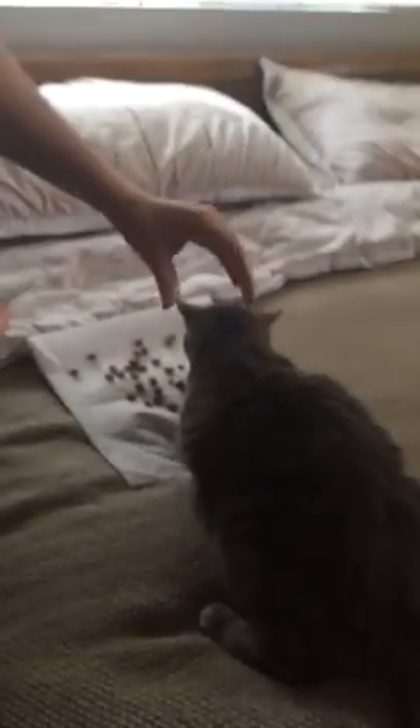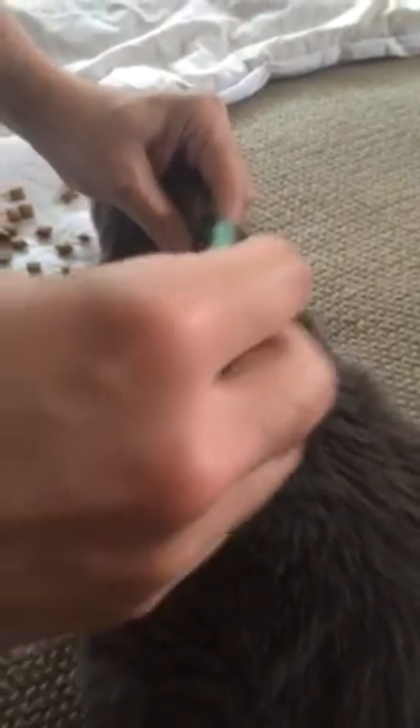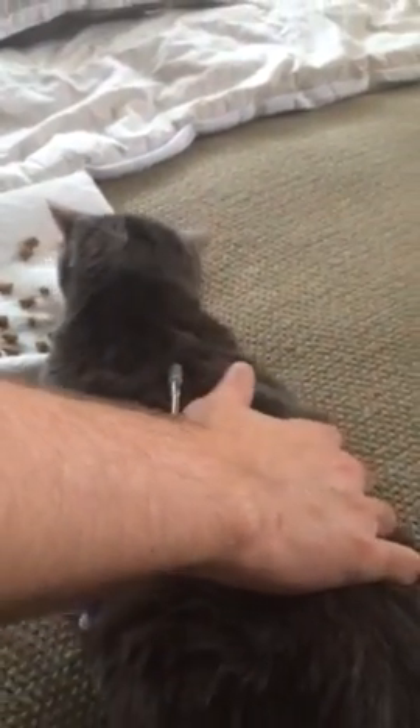What I do is I grab like this, sort of against his body, and I pinch a little tiny bit, and then I just go in. He flinched a little bit but he's fine — now it's in.